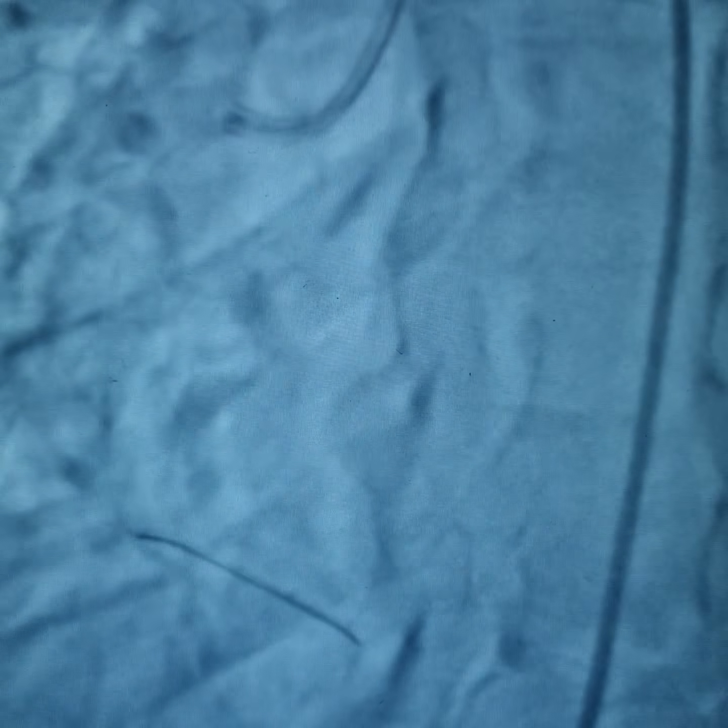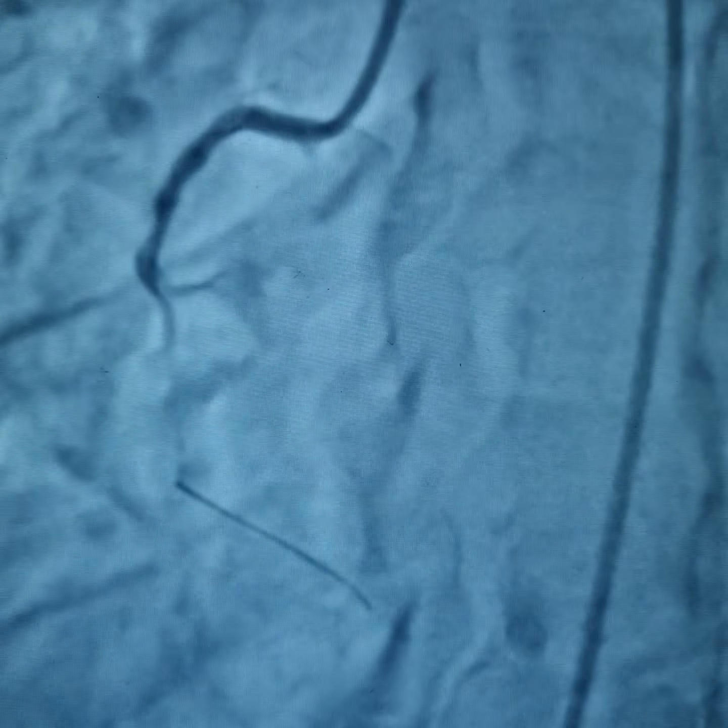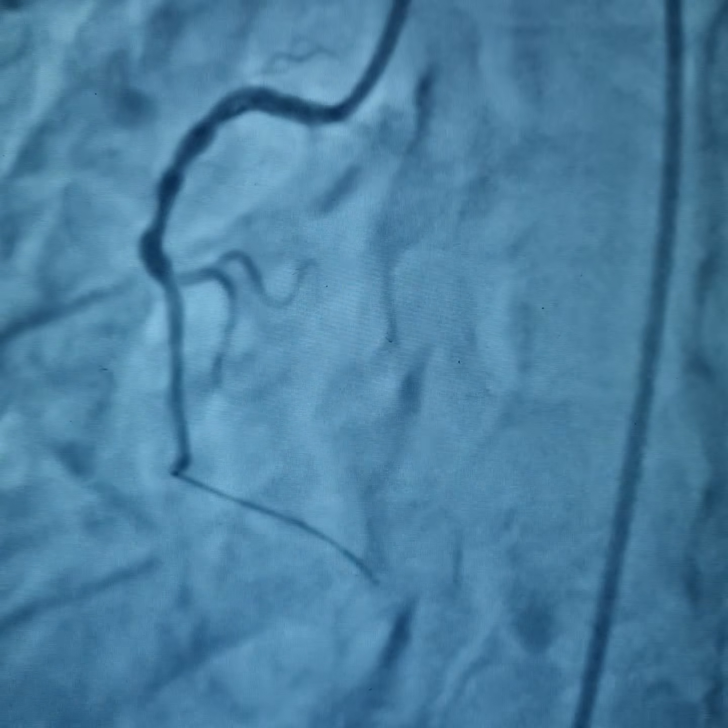To be honest, it was not a very easy wiring because of the large side branch, and so anyways, we used a BMW wire, our workhorse wire, and we're trying to measure the lesion, and this is it. Some pre-dilatation is in action right here.